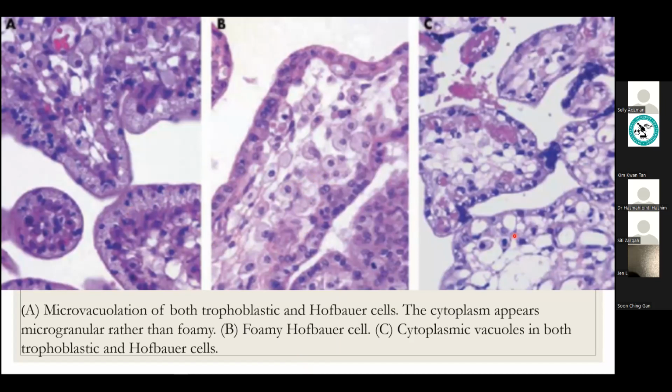The most obvious will be vacuolation in the Hofbauer cells or in the syncytial trophoblast. Only in these two cells will I search for possible inborn error of metabolism. In the report, just state the speculation of changes within the syncytial trophoblast and Hofbauer cells, raising the possibility of inborn error of metabolism. Please investigate clinically, something like that. Okay.